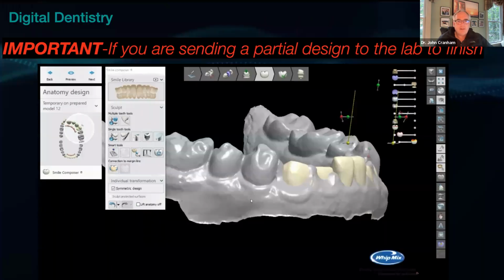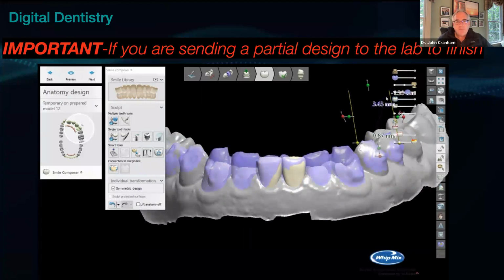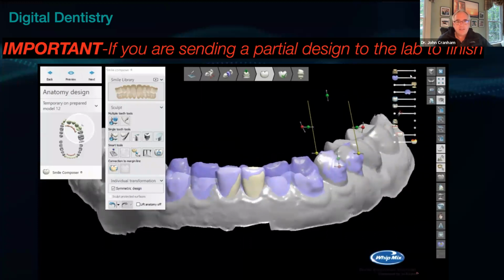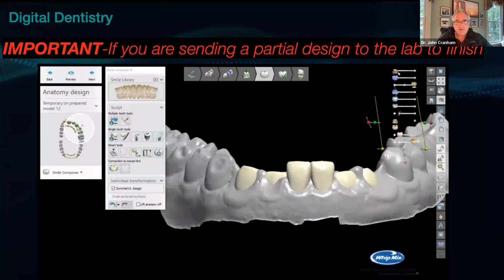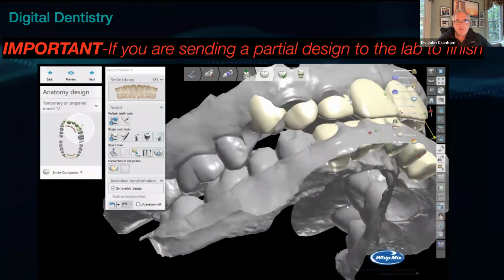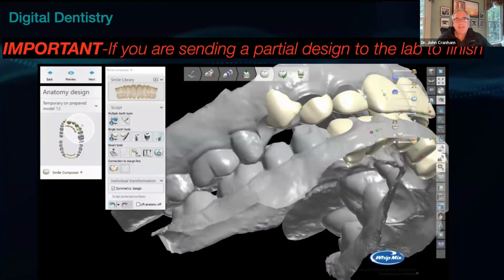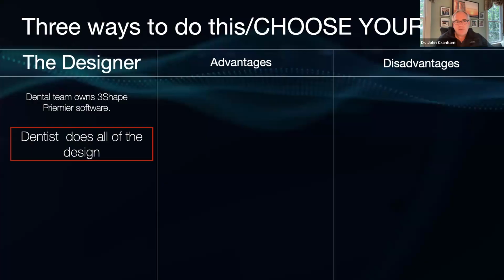Again, the important thing is if you're going to send a partial design for a lab to finish it, where you're maybe going to go ahead and set just 2 central incisors, that's a pretty good way to do it, because you're just setting up 2 teeth. If the lab can see where the 2 centrals are, they can often finish it and make the details, they get all those little fine details. So sometimes that's what we've got docs doing, is just setting up 2 centrals.